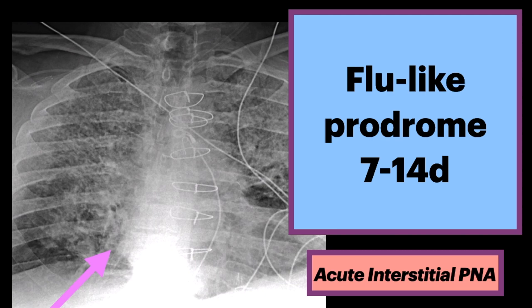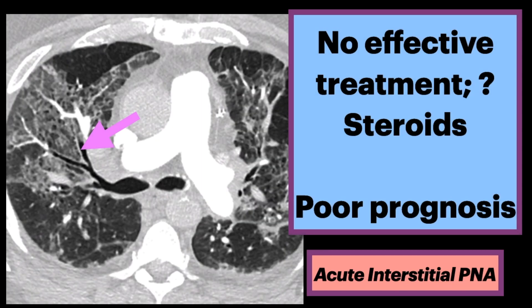This AP chest X-ray of an adult male with AIP during the early phase shows diffuse bilateral heterogeneous and reticular opacities. The corresponding CT of the same patient shows crazy paving and bronchiectasis.